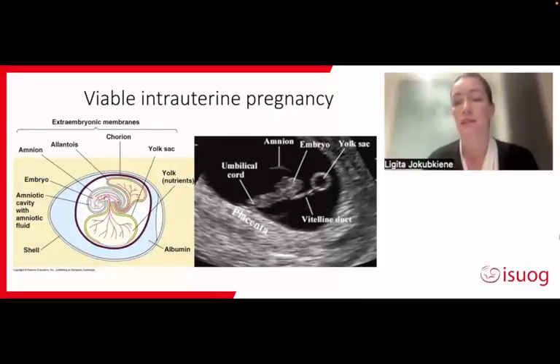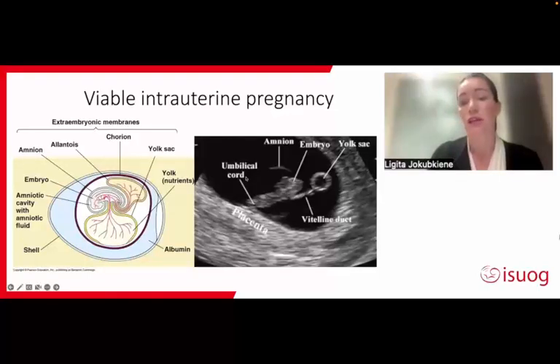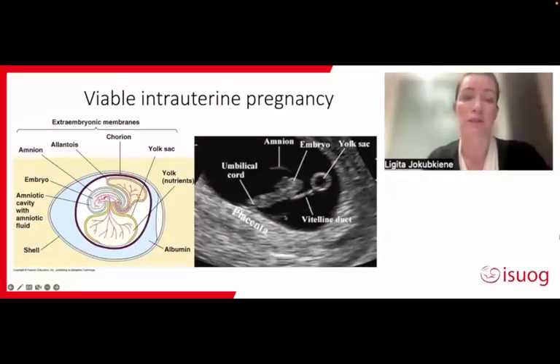We can assess the shape and the presence or absence of the yolk sac. Then we look at the embryo, if we see any embryo. And we also have to assess the amnion, which is an important structure, particularly for the prognosis of the early pregnancy. So knowing all these structures and knowing the normality of these structures at ultrasound is essential when we assess women with early pregnancy.